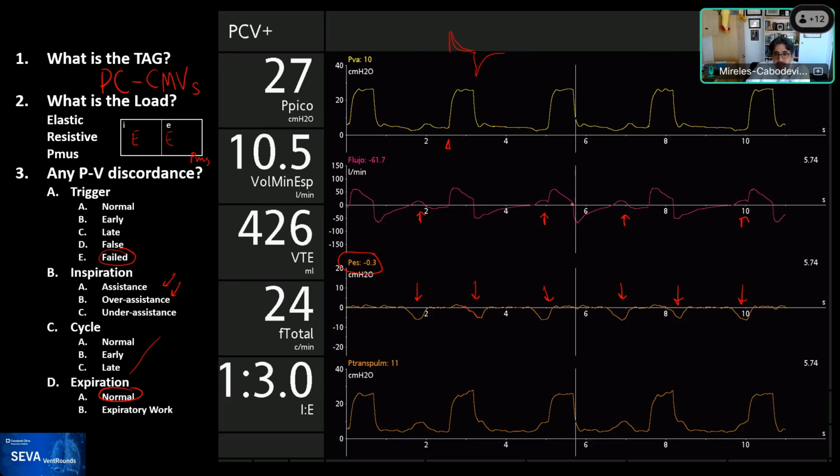And on this one, the patient was essentially passive during that period of time, and it reached basically zero. Here the patient does inspiratory effort, so the flow goes above baseline, and then exhales, and then the patient takes a breath, the machine delivers a breath, and the patient does effort, and as the patient does effort, the flow ends up higher.